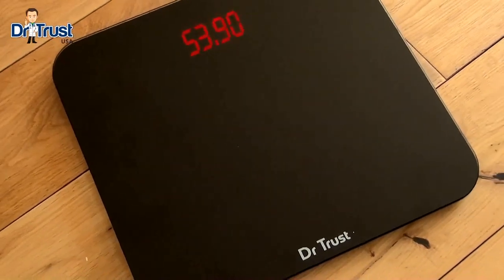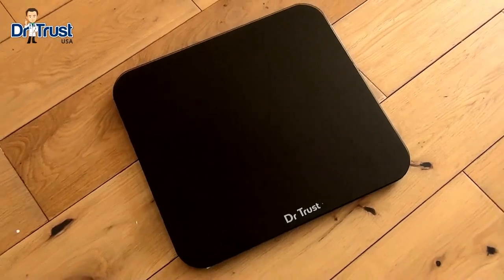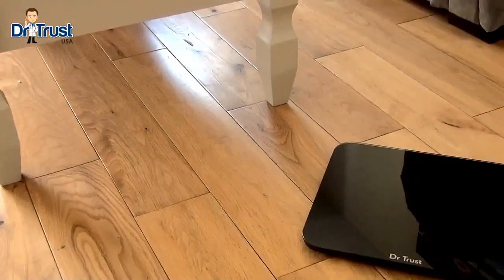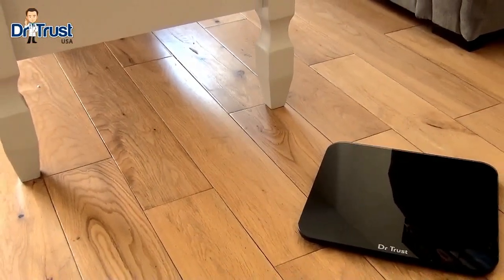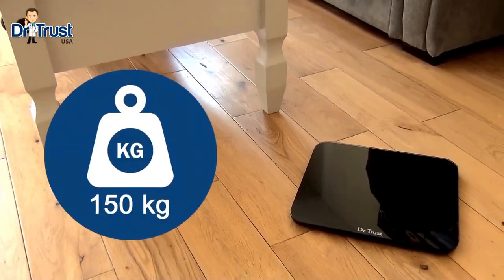Introducing the Dr. Trust Zeus Eco Recharge Personal Scale for high-precision, eco-friendly weight tracking. This sleek and stylish black scale is perfect for any modern home and can hold up to 150kg in weight.